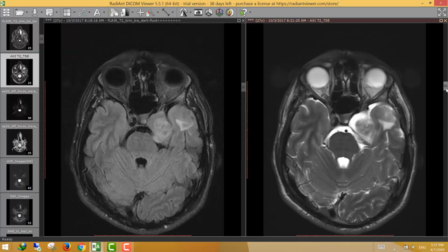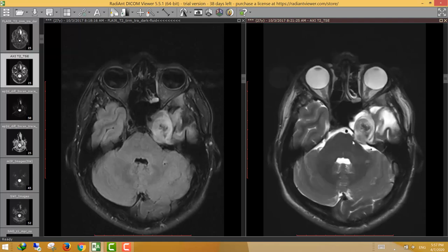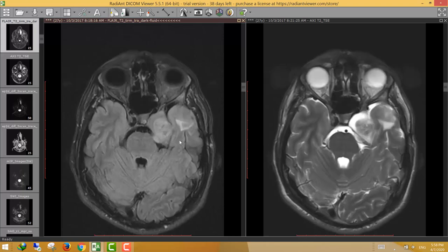Also, in these lower sections, we can see there is a fairly well-defined lesion at the left paracavernous region. It exhibits a heterogeneous predominantly low signal on T2 and heterogeneous intermediate to high signal on FLAIR images. Depending on the location of such a lesion, there is a wide differential diagnosis. As we know, there is a cavernous sinus in this location, so it could be one of the content-related lesions.